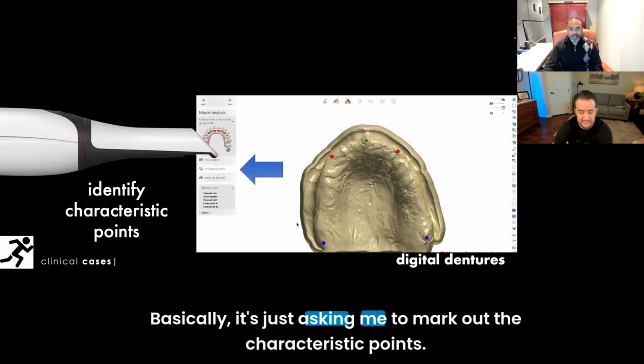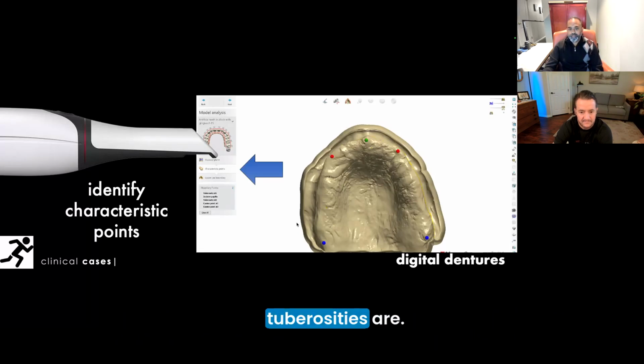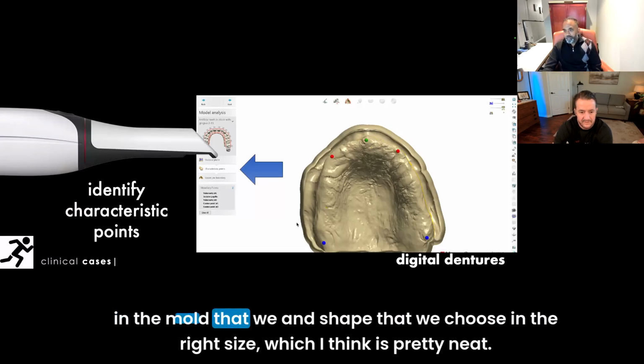Basically, it's just asking me to mark out the characteristic points. So I'm going to mark out where the canine point is, mark out where the incisive papilla is, mark out where the tuberosities are. And that's going to allow the software to actually propose teeth in the mold and shape that we choose in the right size, which I think is pretty neat.